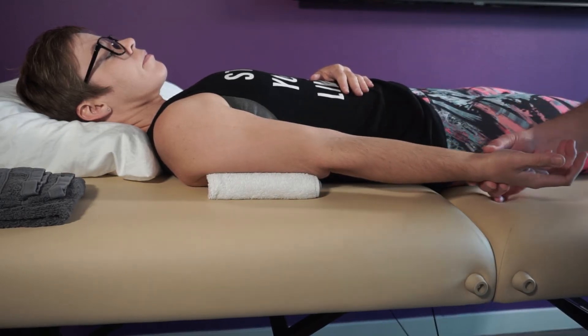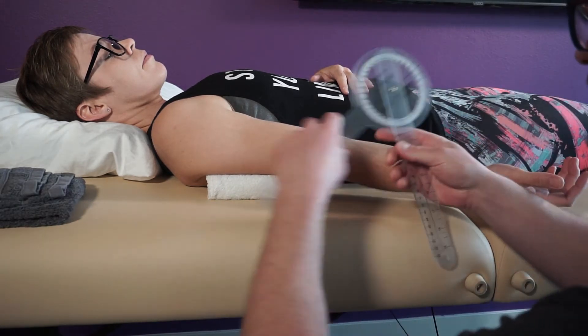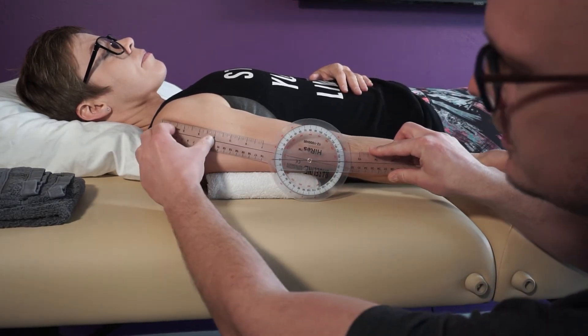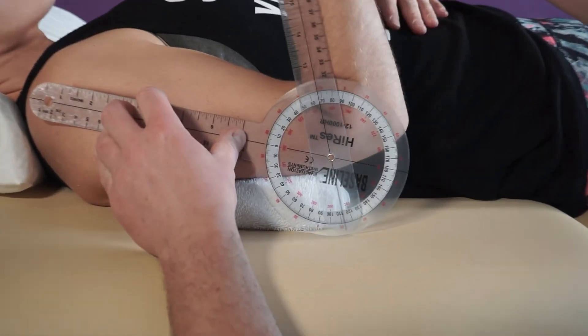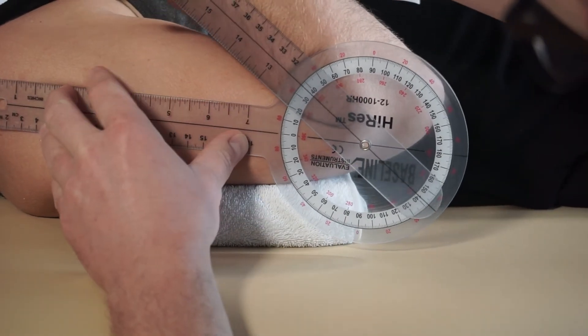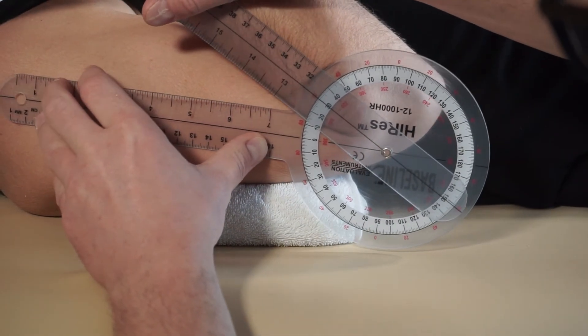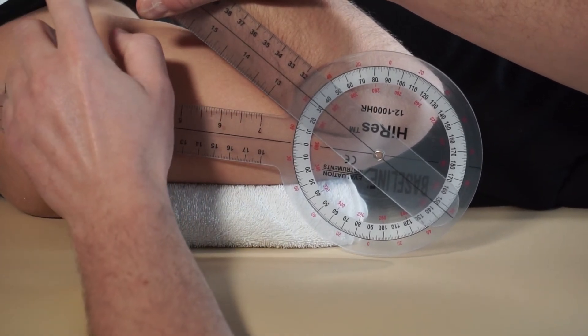Now we're going to line that goniometer up and do elbow flexion first. Go ahead and flex your elbow as much as you can. You should be thinking about what end-feel you're looking for here — and hopefully you say soft. You can see up here at the wrist if you're digging in there.